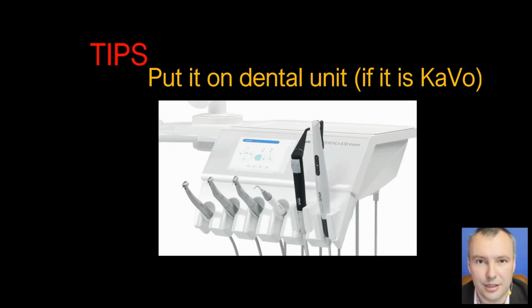If you have a dental KaVo unit, put the DiagnoCam on the dental unit, especially on the assistant's table. It is working well, very useful with work. If not, then use the holder. But again, think if you can maybe glue or mount the holder somehow on the dental unit.